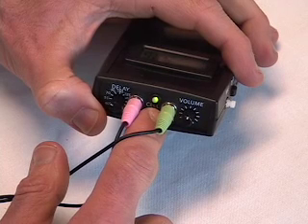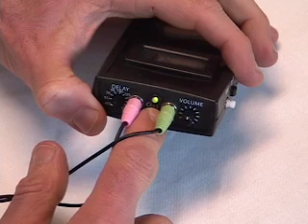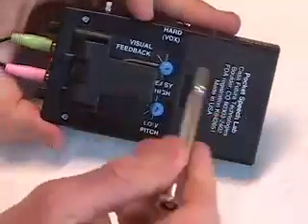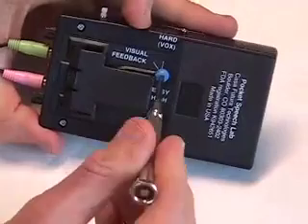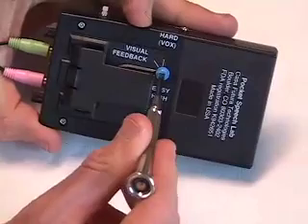you're ready to use this feature on a telephone call and then in a face-to-face conversation. You can adjust the sensitivity of the vocal tension biofeedback. You may want to start with it at easy and work your way up to the middle position.